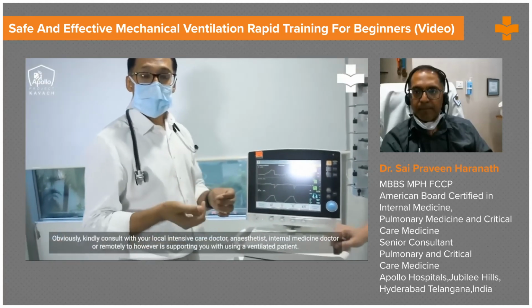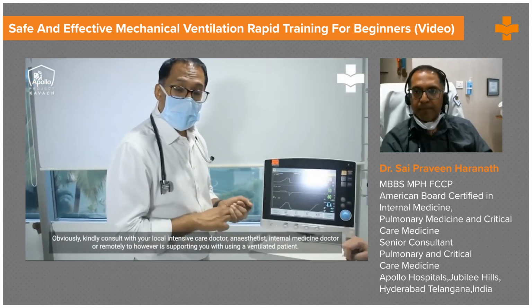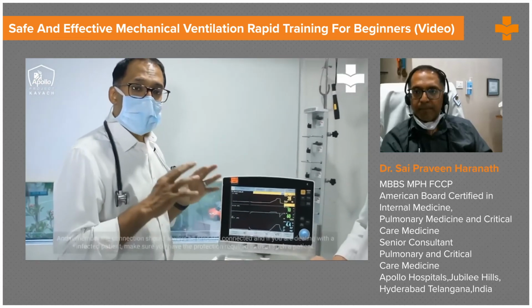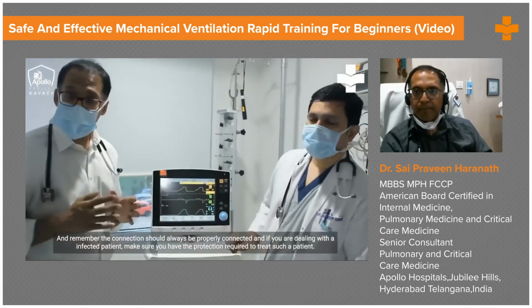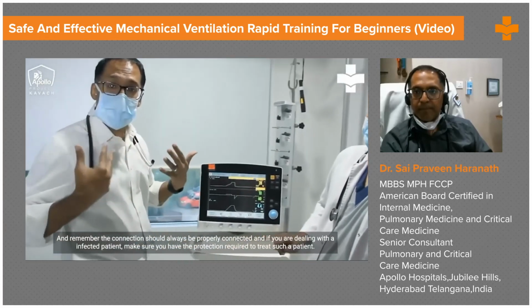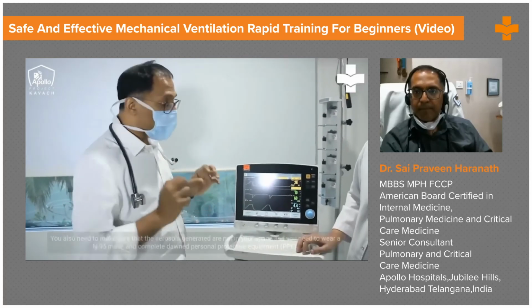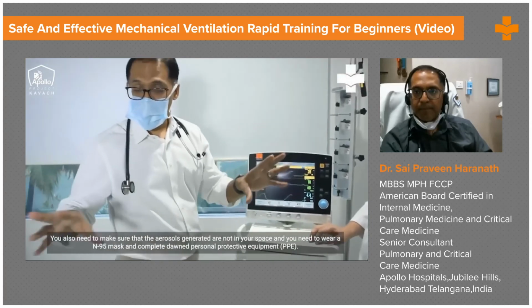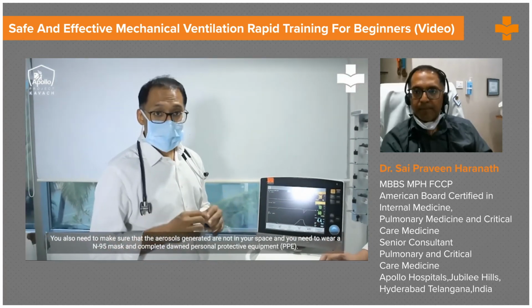Obviously, kindly consult with your local intensive care doctor, anesthetist, internal medicine doctor, or remotely through whoever is supporting you with using a ventilated patient. And remember, the connection should always be connected. If you are dealing with an infectious patient, make sure that you have complete personal protective equipment to make sure that you are completely protected. You also need to make sure that the aerosols generated are not in your space. You need to wear an N95 mask as well as complete donned personal protective equipment.